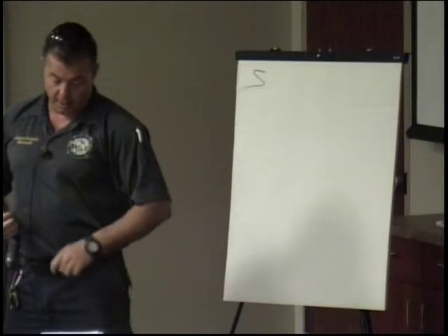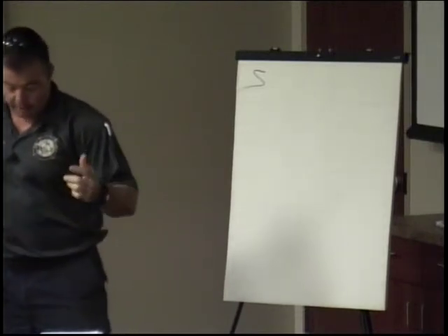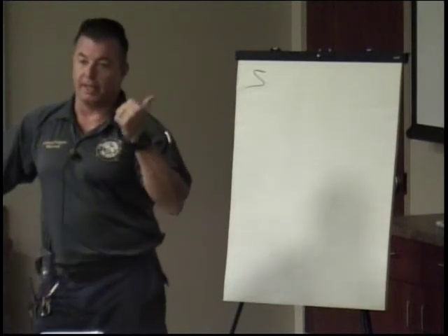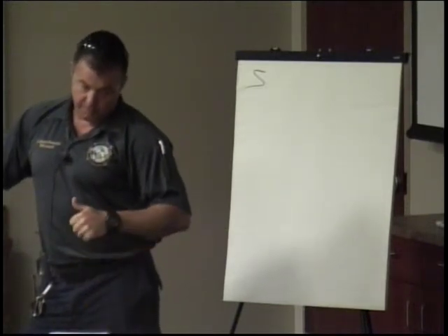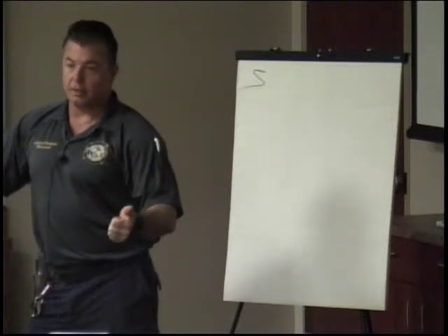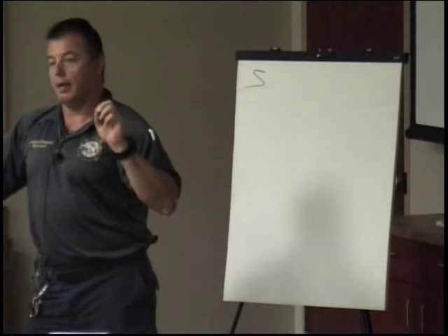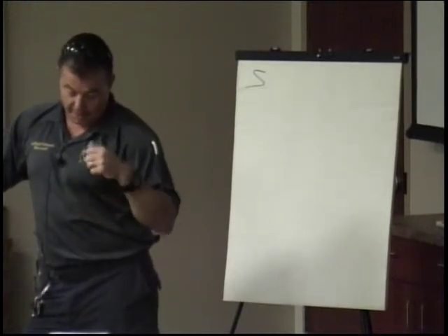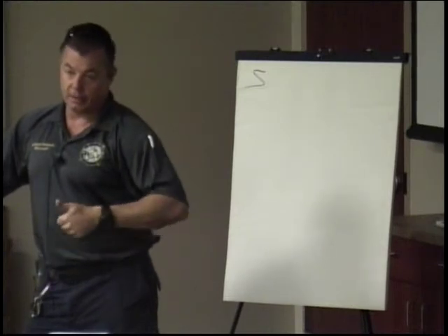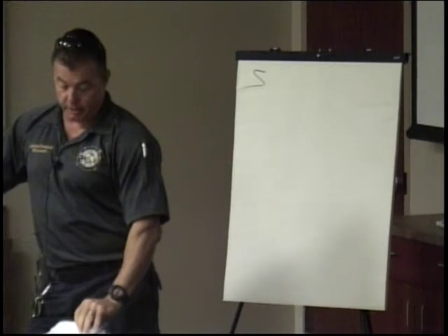Good. Yeah, oxygenation is O2 to the tissues, and ventilation is the movement of air, getting rid of that CO2, basically. Pulse ox is measuring oxygenation, and it's a delayed number, basically. And end-tidal CO2 is an immediate number, and that's measuring the CO2.